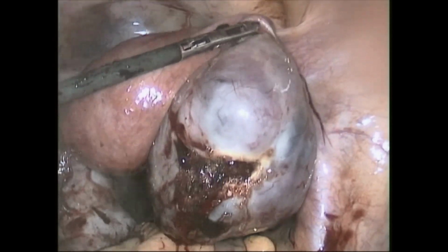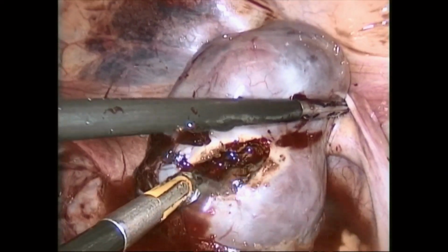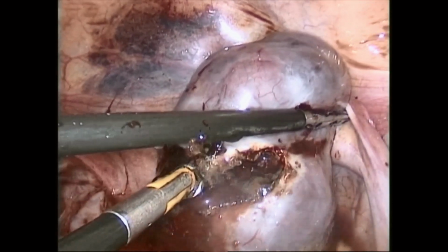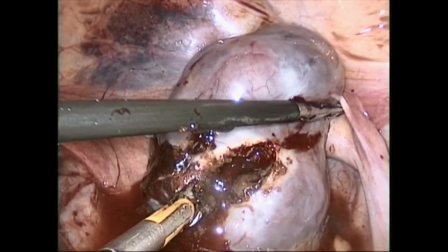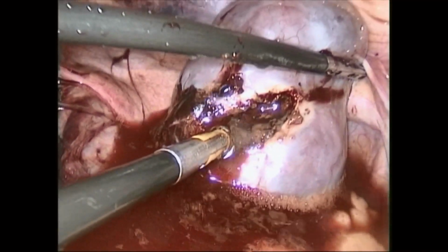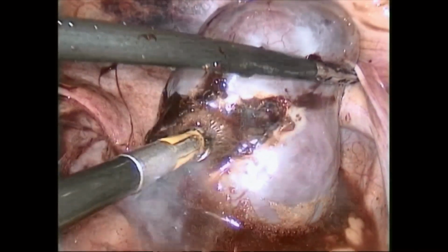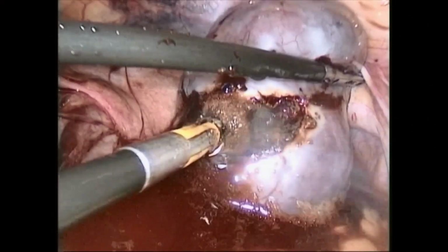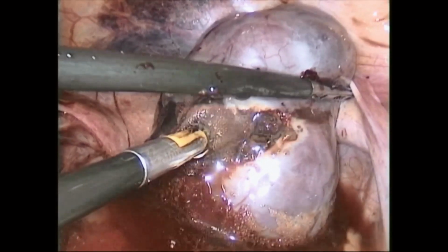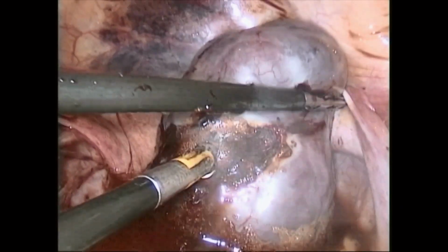Now you can appreciate that it was taken care of. There was no bleeding. Then you can just put an Abgel or something to prevent further bleeding. The ovaries are so fragile that even by holding them, they might get torn.